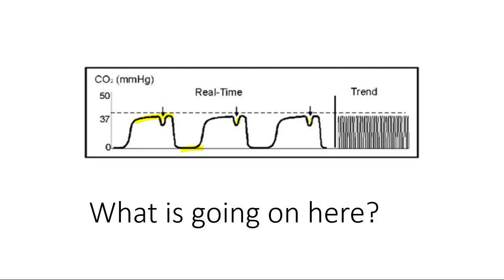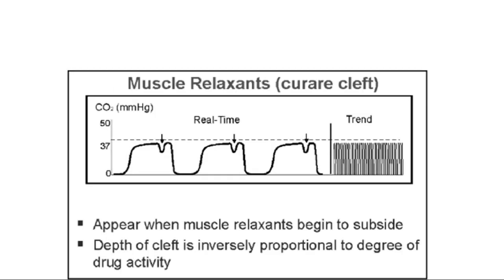Pause and contemplate. So this is the Curare cleft that we spent time talking about. You can also look at your heart rate. This is a sign that the patient's starting to breathe over your machine, which may or may not be something that you want. It may be a sign your sedation or paralysis is wearing off. So that's something you need to consider. Notice your trend is the same, but your waveform is the clue.